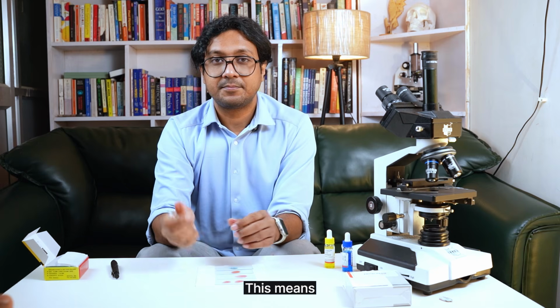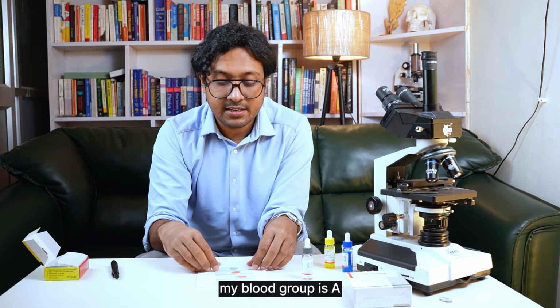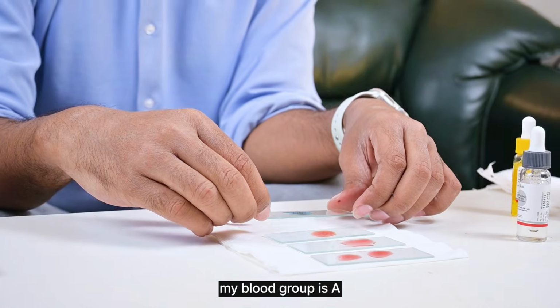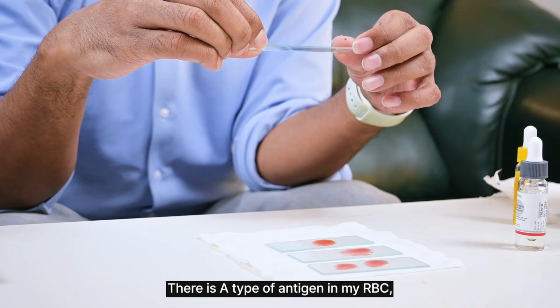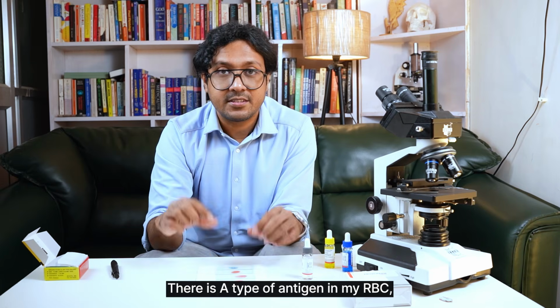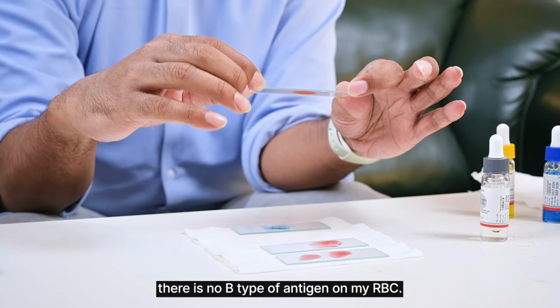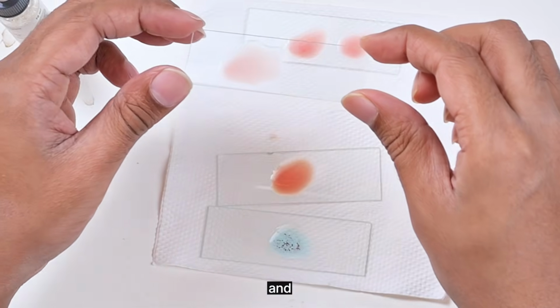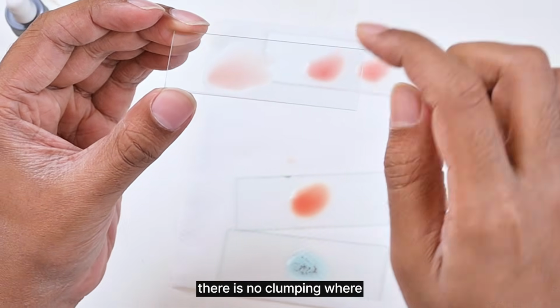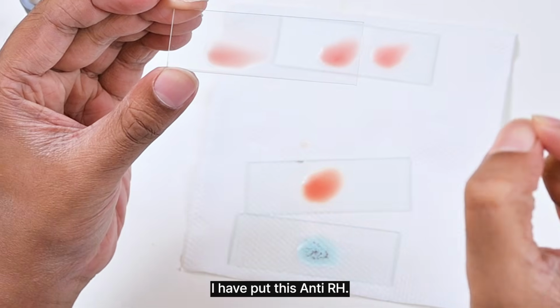This means my blood group is A. So there is A type of antigen on my RBC, there is no B type of antigen on my RBC, and there is no clumping where I have put anti-Rh.